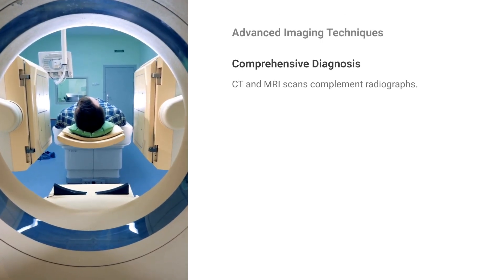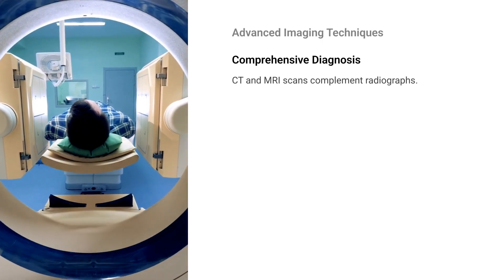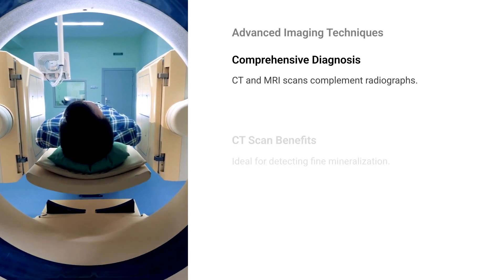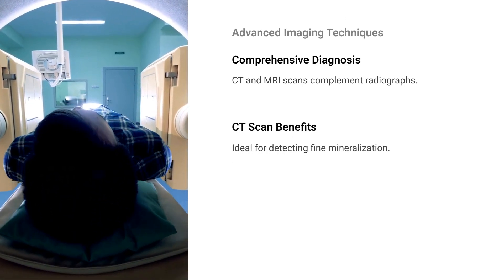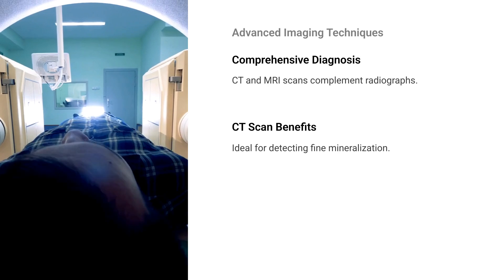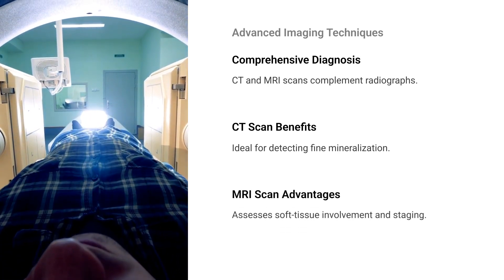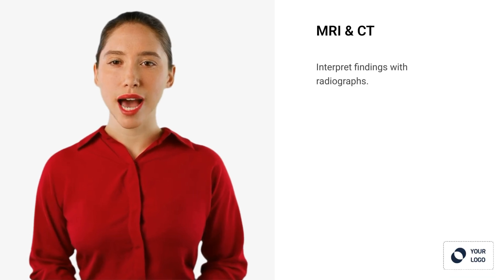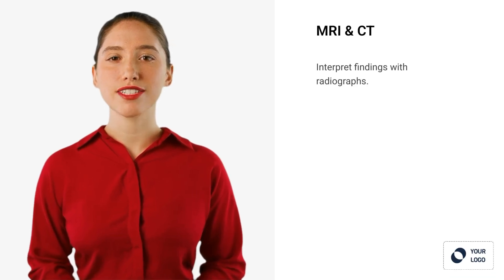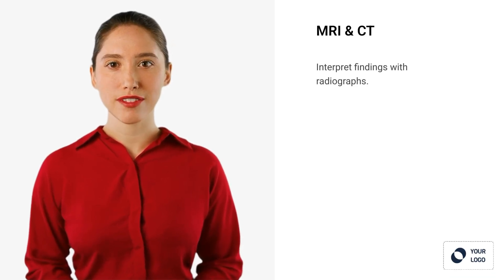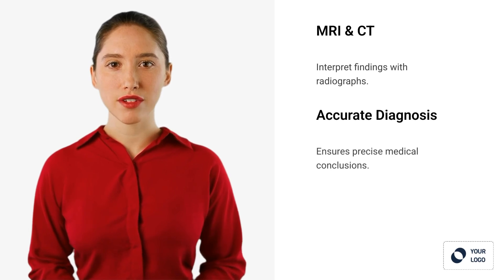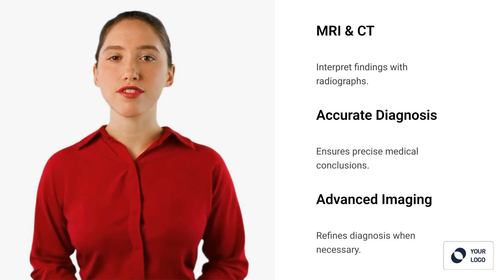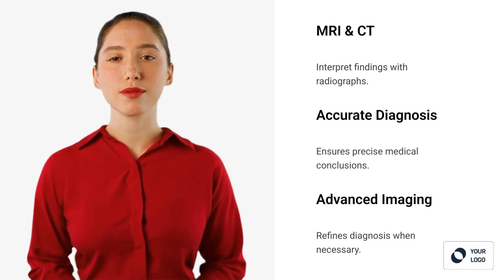CT and MRI scans complement radiographs for a comprehensive diagnosis. CT is ideal for detecting fine mineralization, while MRI assesses soft tissue involvement and staging. Always interpret MRI and CT findings alongside plain radiographs for accurate diagnosis. Advanced imaging refines your diagnosis when necessary.